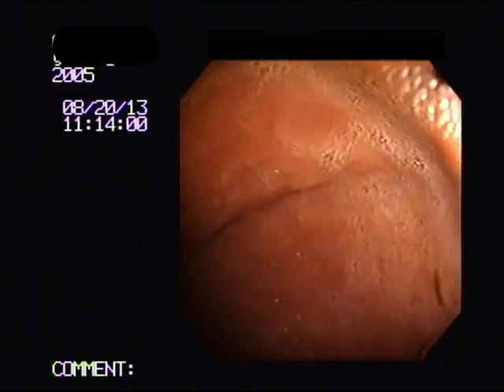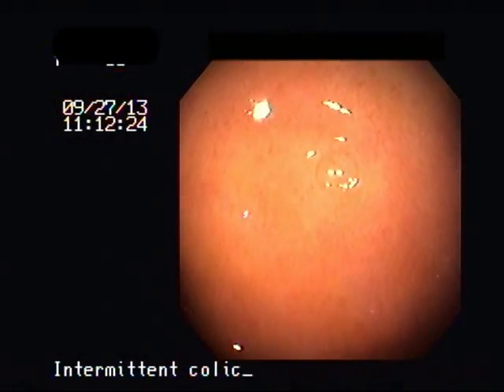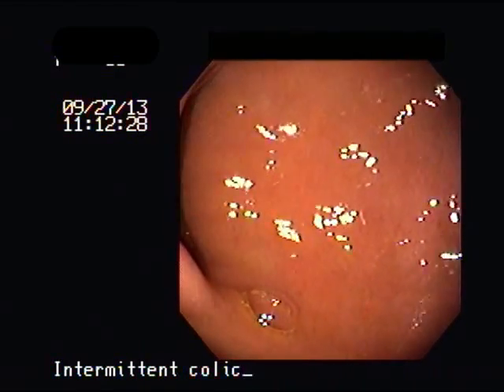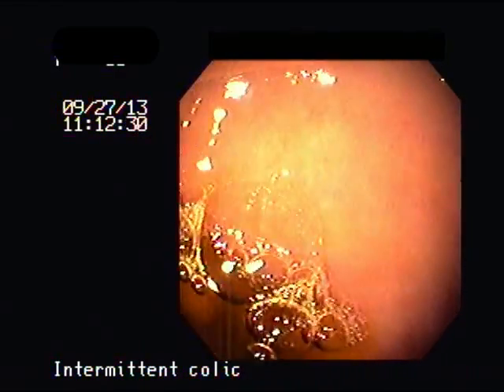We're going to drive our scope into the first part of the small intestine, also called the duodenum, and examine the mucosa which is the internal lining. In this particular case everything looks very good — there are no ulcers.